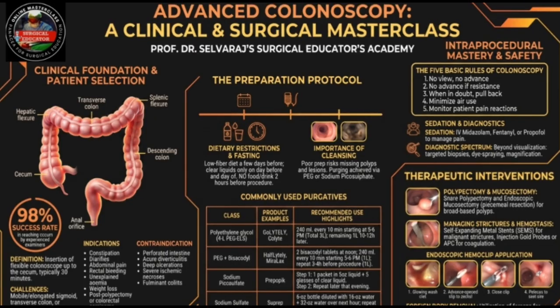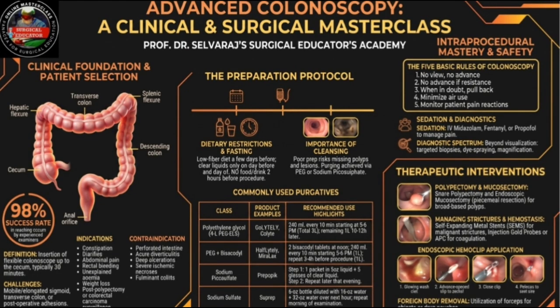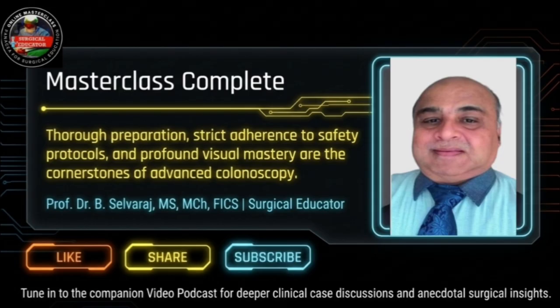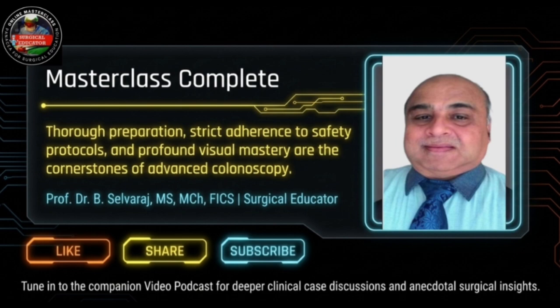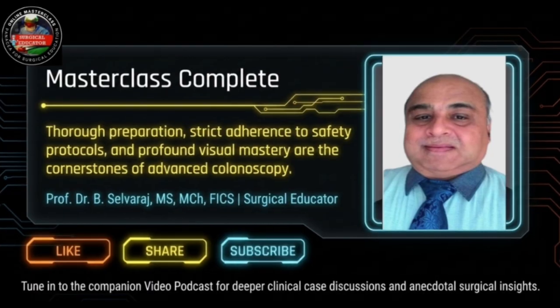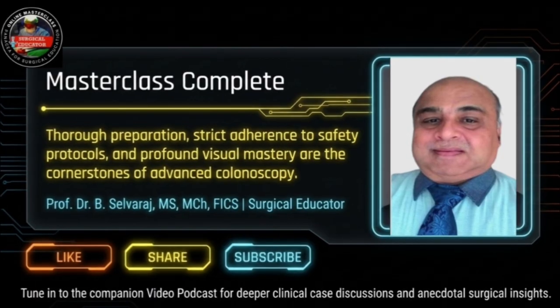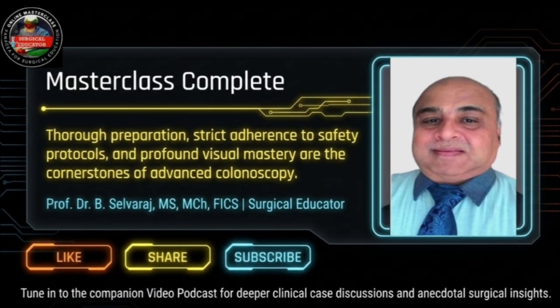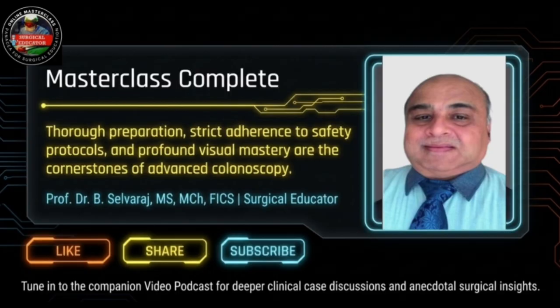Before we close, considering all the intricate visual diagnosis we've discussed today, what is the next frontier for this procedure? You know, I want you to consider the intersection of these manual techniques and machine learning. Oh, interesting. We spent considerable time discussing the difficulty of spotting millimeter-high flat lesions amidst the mucosal topography, right? Right, they hide. In the very near future, real-time AI mapping will be integrated directly into the colonoscope's video feed. It will instantly highlight abnormal cellular patterns and flat lesions that are virtually invisible to the naked eye.